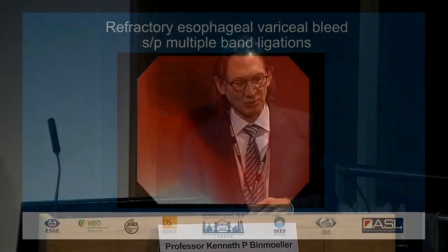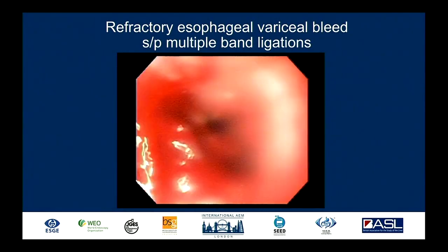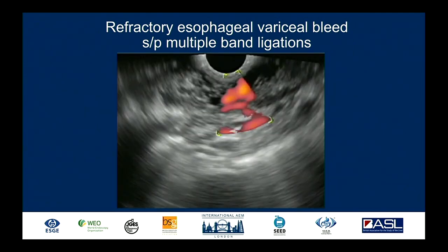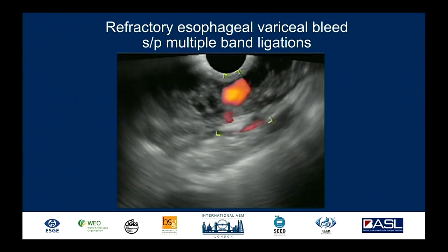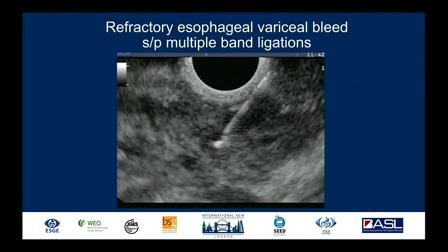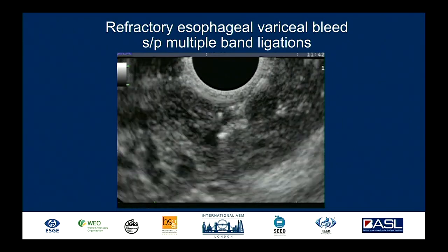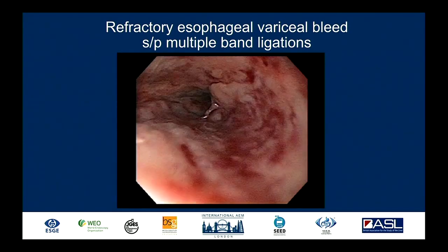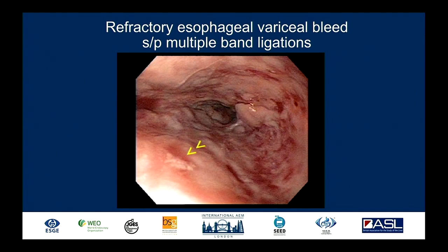This patient with esophageal varices had undergone multiple band ligations and again presented with active bleeding. Rather than another band ligation session, we switched on the Doppler and identified the varix, the perforator feeder vessel, and the collaterals. We then targeted the perforator under ultrasound guidance. The cyanoacrylate, which is very echogenic, filled those collaterals and obliterated the entire network — which we can only see the surface of with endoscopy. The bleeding stopped, and the patient had no further bleeding.